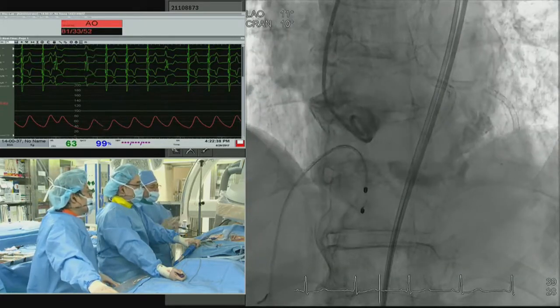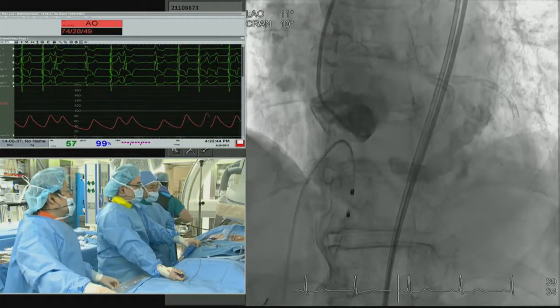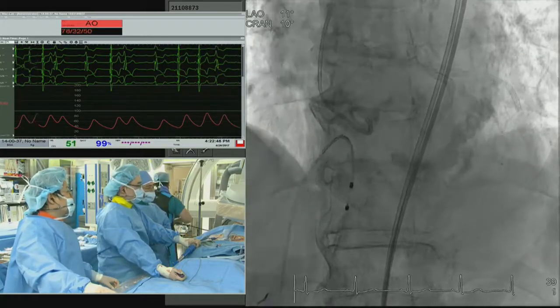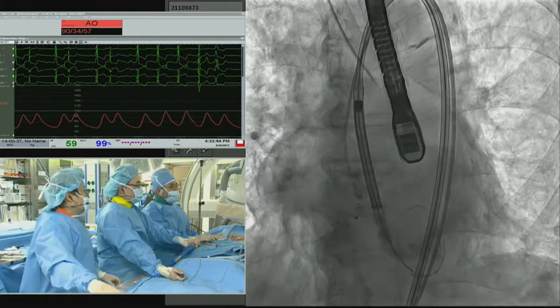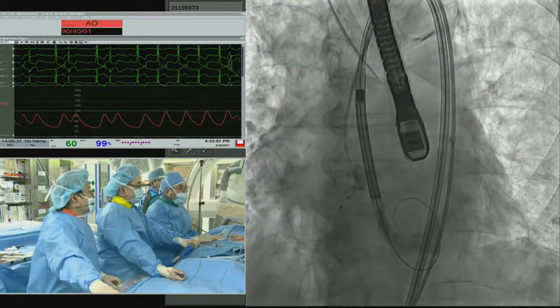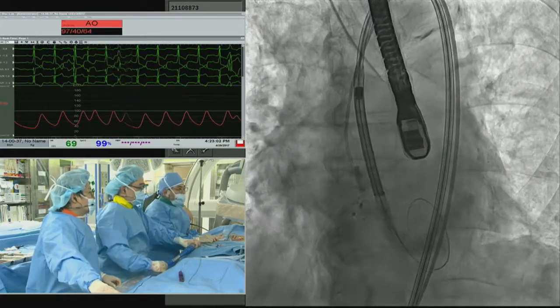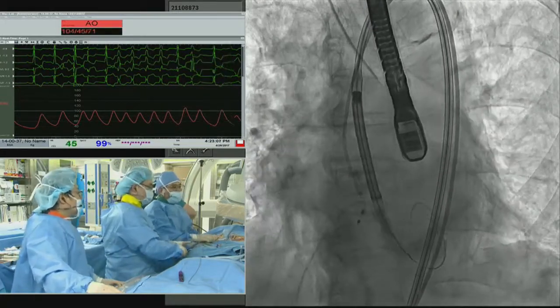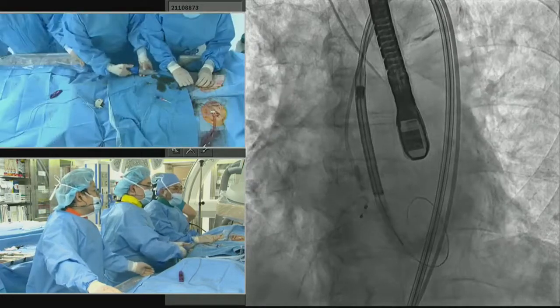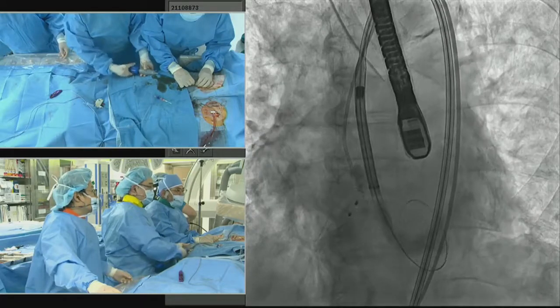Can you do the implant right now? Okay, we just had some discussion. Yeah, I think that you're in a good position. Your blood pressure is coming a little bit softer. So this is actually, the depth is 3. The depth target is 3 to 5. Now we start. We don't need pacing. So you're just below the annulus, starting. Yeah, just below, beautifully.